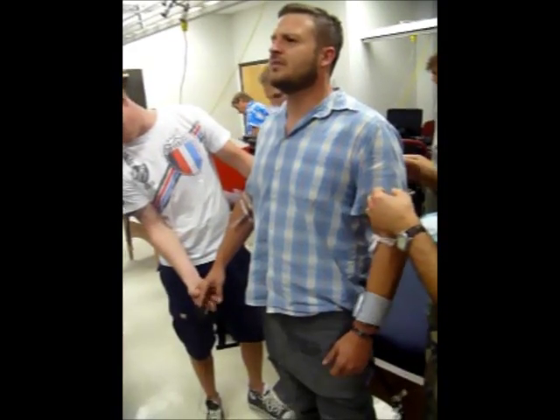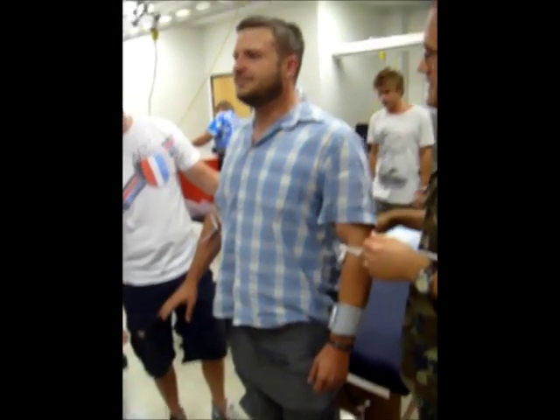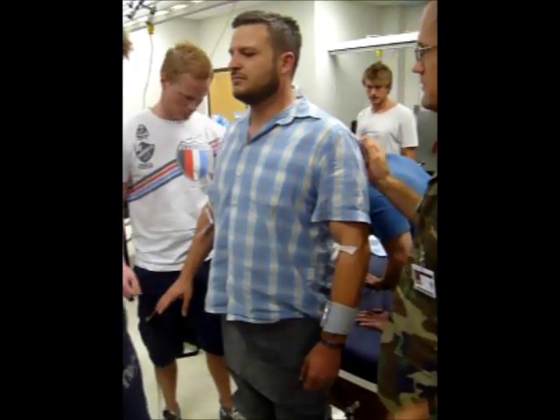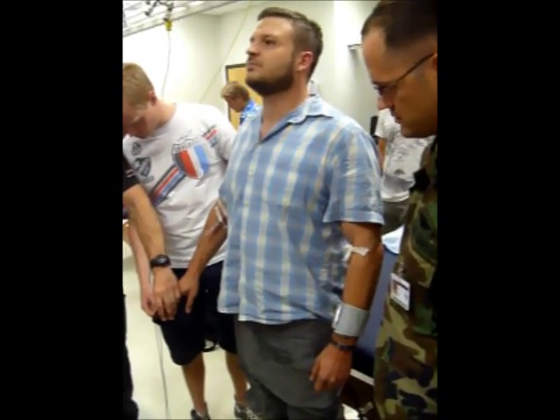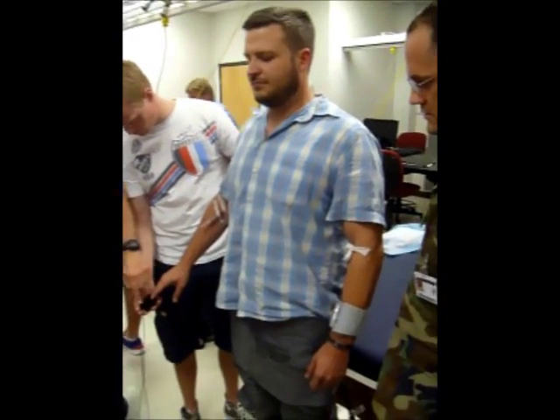Feel okay? You have the pulse ox on? A little fuzzy. Start watching his pulse. So when it's blinking like this, it doesn't really capture him. You want it to blink green, so fidget around a little and try to get it blinking green.